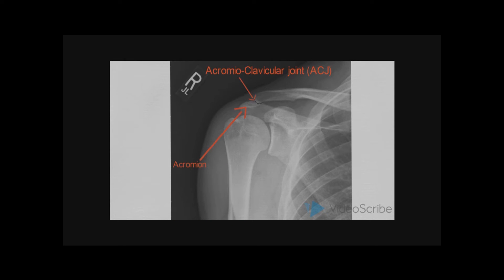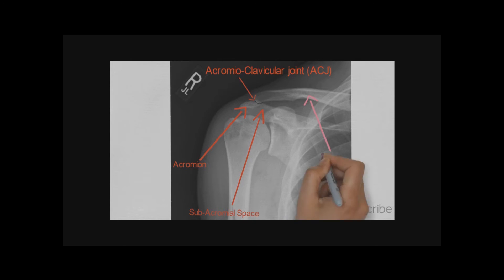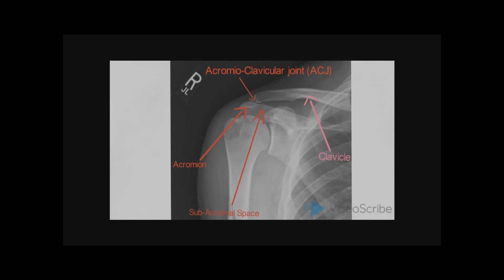We then also need to identify the acromion. When identifying the acromion, we may as well also look at the acromioclavicular joint. We need to assess the body of the acromion, the joint space in the acromioclavicular joint, and the relationship of the acromioclavicular joint to the coracoid process.